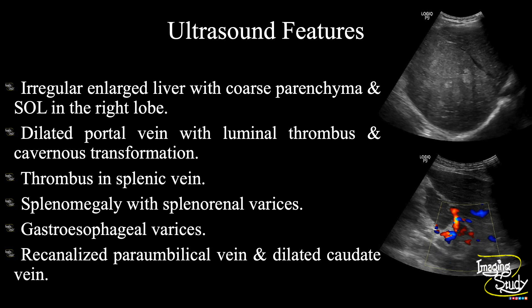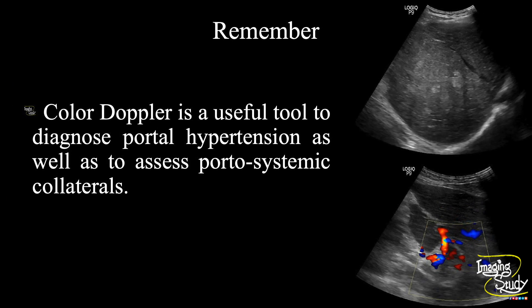Have you detected any important features missing? We found only a negligible amount of collection at the iliac fossa — we expected a good amount of ascitic fluid here, which was not present. The take-home message: color Doppler is a useful tool to diagnose portal hypertension and to assess portosystemic collaterals. So if you have Doppler facility, always in a case of chronic liver disease, try to search for portosystemic collaterals.